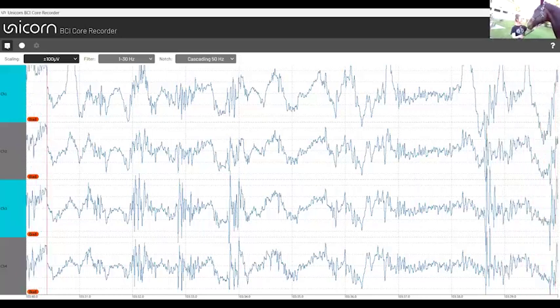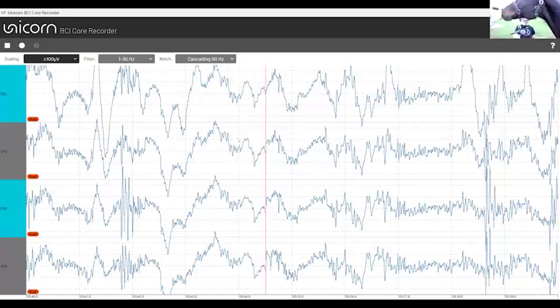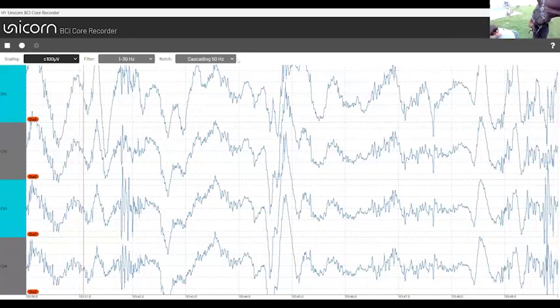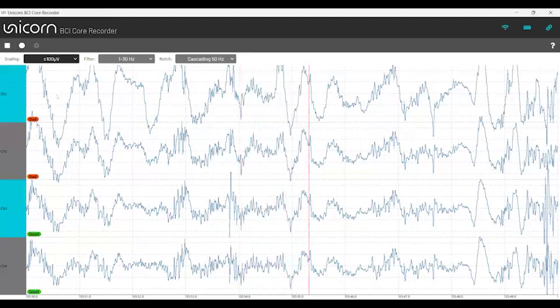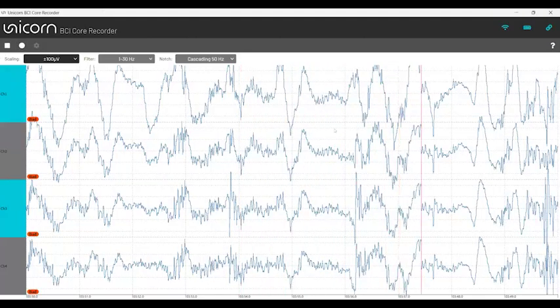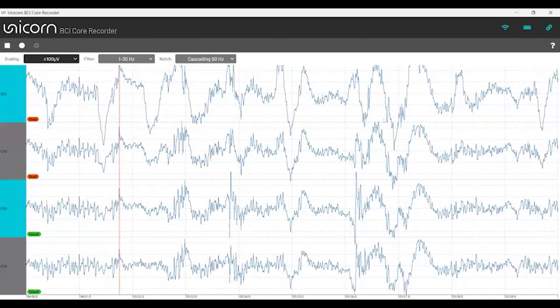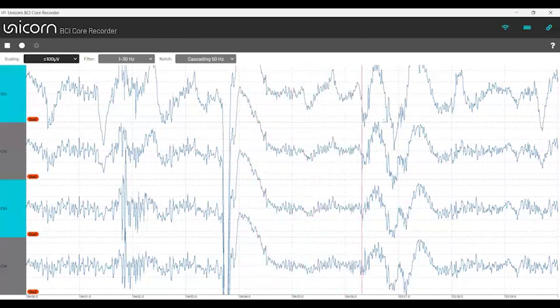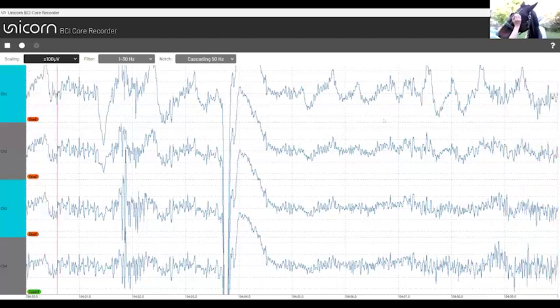So Dream is actually quite easy, and the measurement, what I'm doing now, I'm selecting BCI Core-8. And maybe first, if it's possible to see some alpha, can you somehow shade his eyes? Maybe Susie can do it. If the eyes don't get visual input, we should see some alpha waves. Let's see how Dream is going.